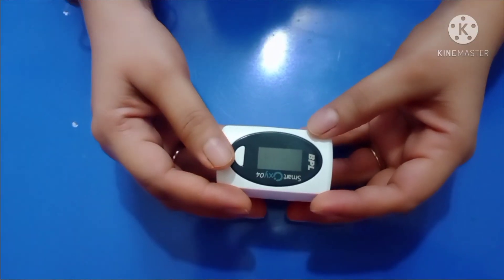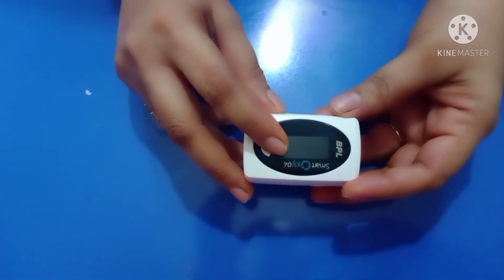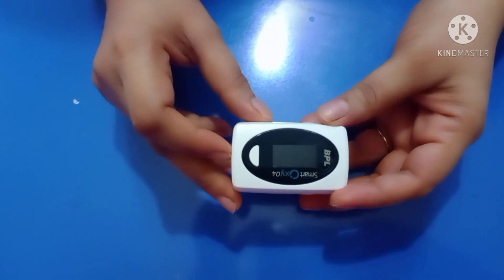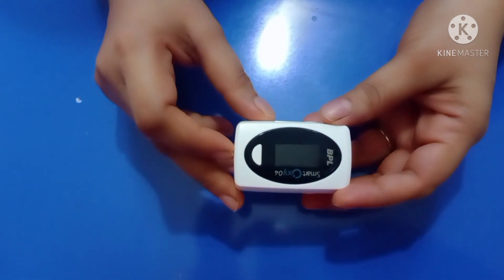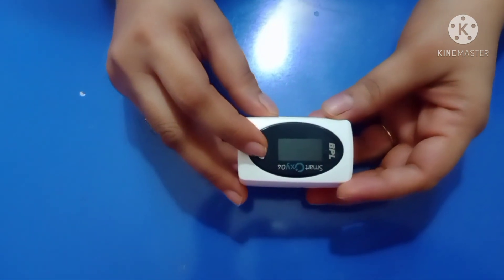In this video I am going to discuss some important aspects related to pulse oximeter. This is a pulse oximeter — it is a small portable clip-like device which is battery operated. This is a display which shows readings. It is a device which detects blood oxygen saturation level, that is SpO2, and heart rate.